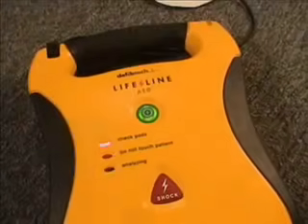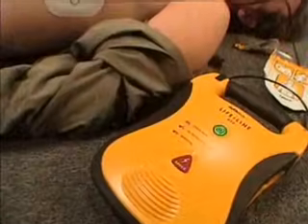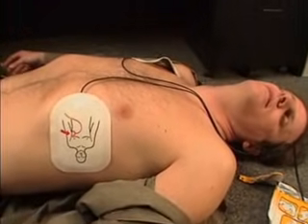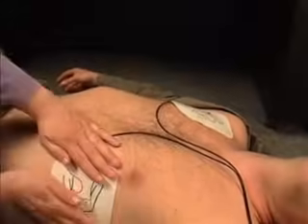The unit automatically checks the connection of the pads to the victim and lets you know if the connection is bad. Make sure the pads are properly attached to the victim and not touching each other. If needed, reposition the pads and dry or shave the victim's chest.